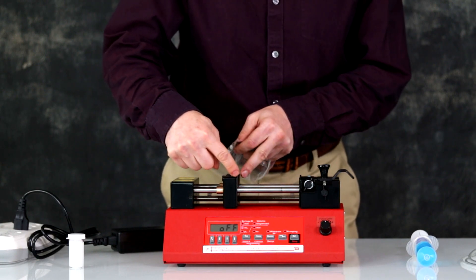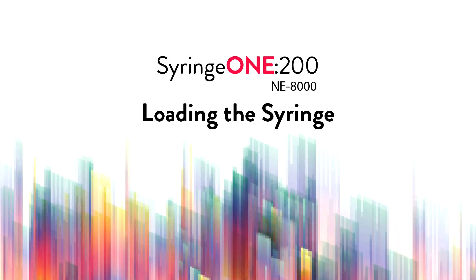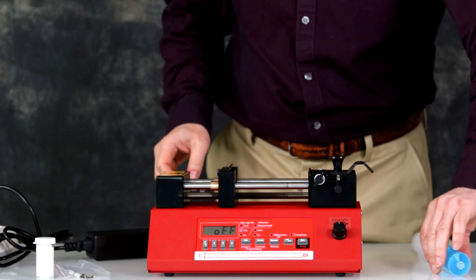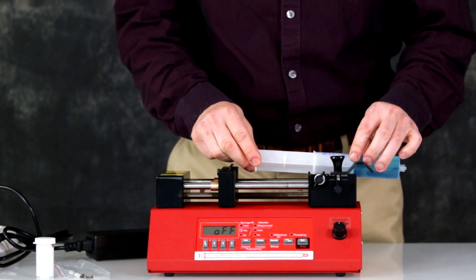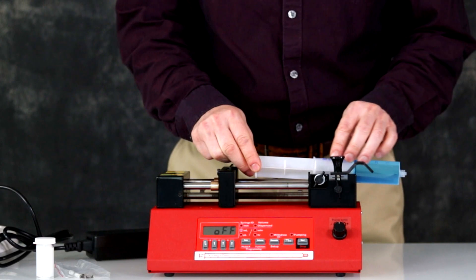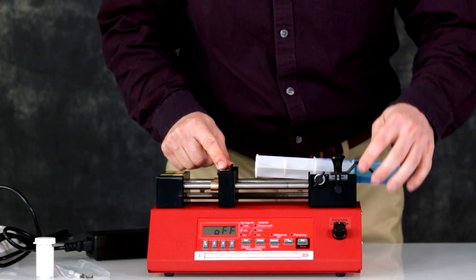NE-8000 loading the syringe. To install the syringe, put it on the syringe holder. The pusher block is moved by using the purge function. Press and hold to go forward or reverse.